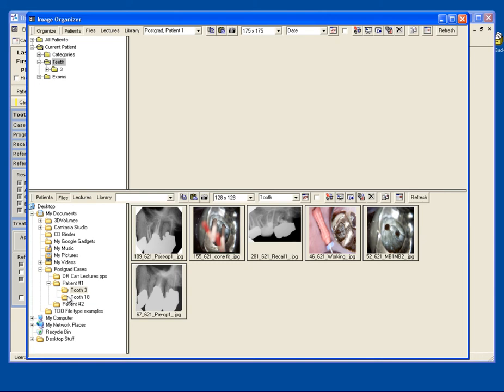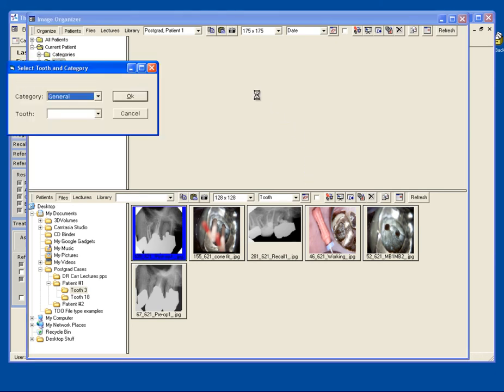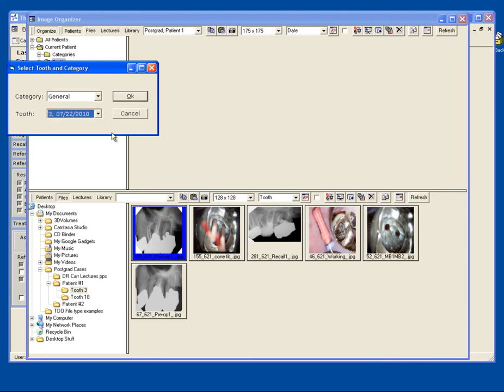I'm going to bring in these pictures from a thumb drive to my current patient's tooth 3. I simply click, hold, and drag to bring it up. I can pick my category and my tooth number.